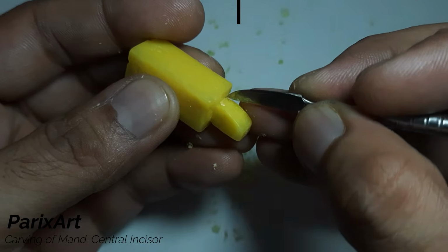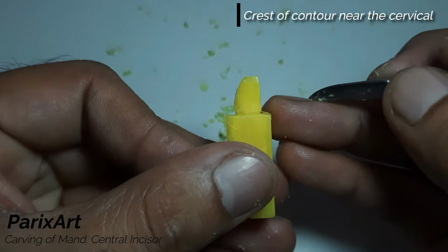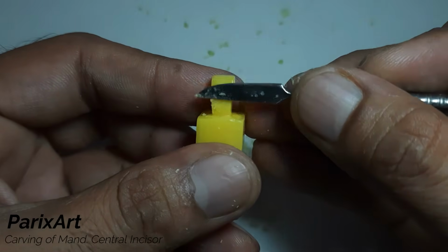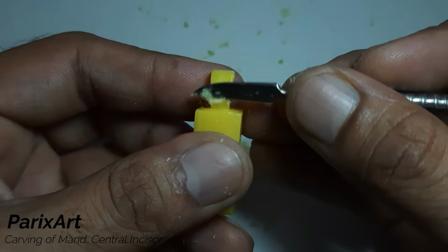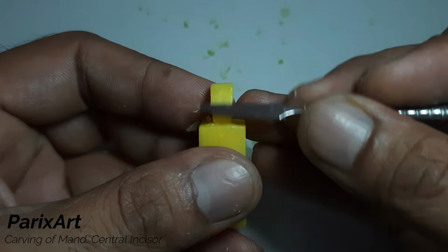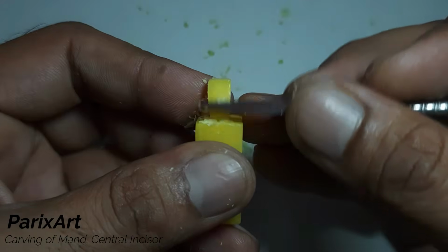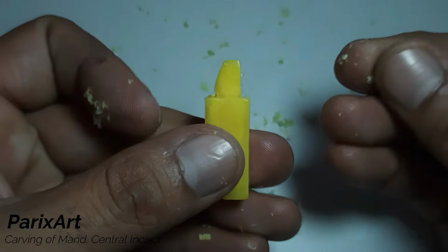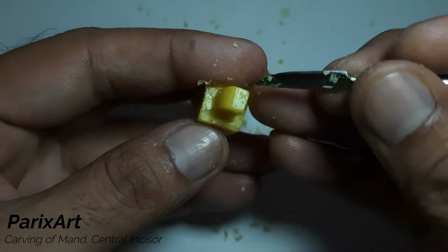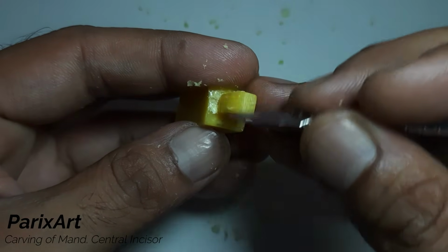Now slightly contour below the crest. See the contour? We need to flatten the incisal two-thirds. If you develop these bumps, carve lightly in this angle to make them leveled. Incisal edge should be more towards the lingual. See the incisal edge? We'll shift it towards lingual and make the incisal third flatter.